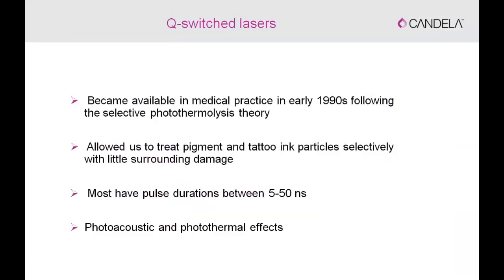Most of the Q-switch lasers in the market have a pulse duration somewhere between 5 to 50 nanoseconds. Now bear in mind that the shorter the pulse duration, the more photoacoustic effect you would have compared to a photothermal effect when the pulse duration is longer. So the Q-switch lasers will have a combination of a photoacoustic or a photomechanical effect as well as a photothermal effect.